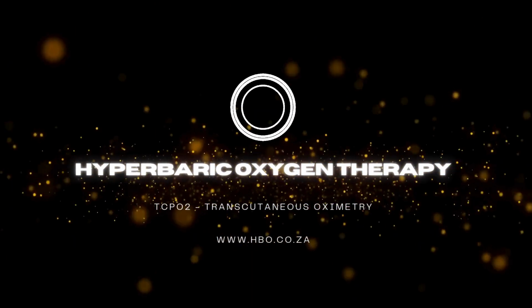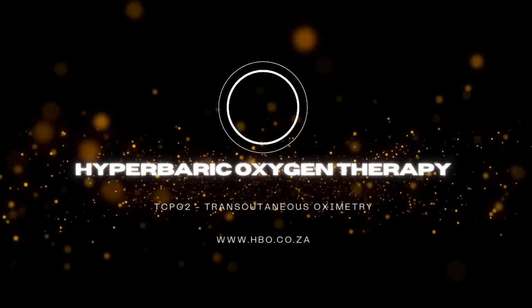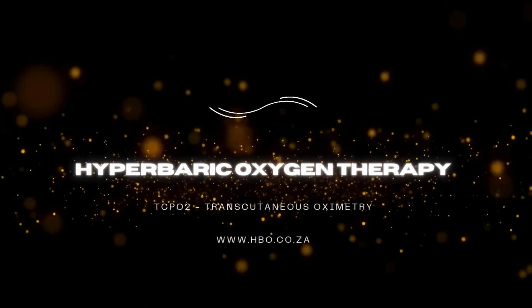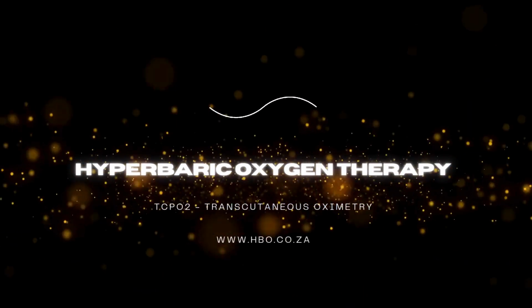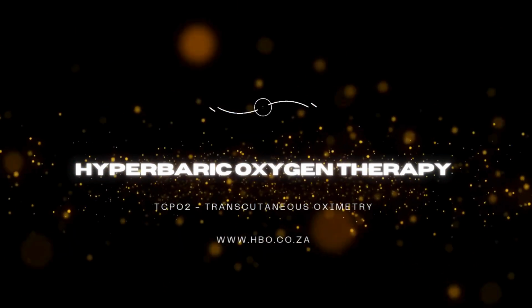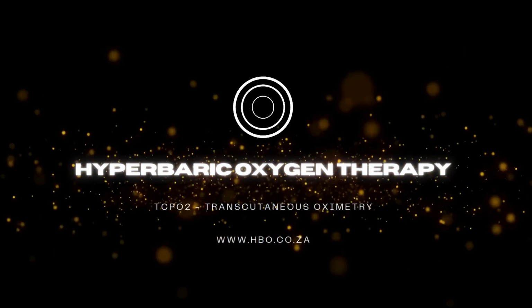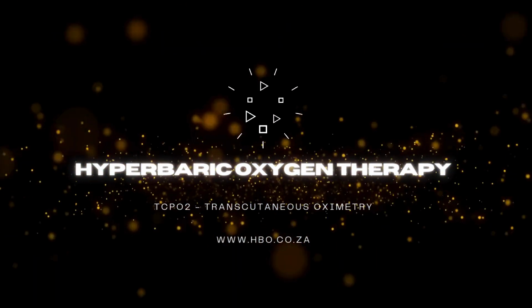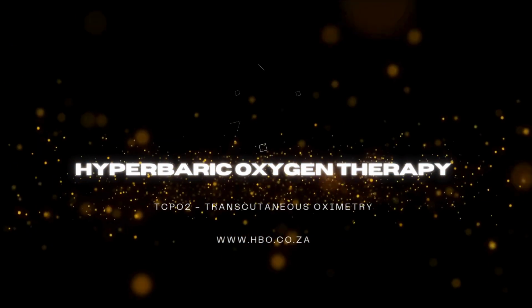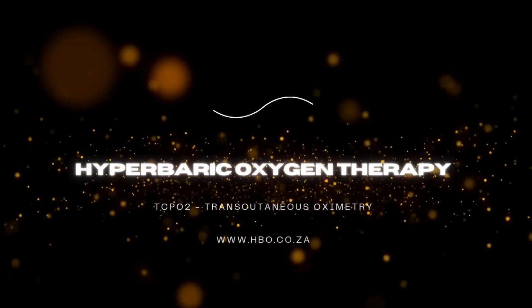Let's drill down into some specific clinical scenarios then. Chronic vascular wounds, ischemic lesions, these seem like prime territory for pairing HBOT and TcPO2. Absolutely. For those, the European Committee for Hyperbaric Medicine consensus back in 2004 really emphasized HBOT's role in getting oxygen back to hypoxic tissues. TcPO2 is the objective measure to confirm you're achieving that. It's especially useful, say, for ischemic ulcers or gangrene, when maybe surgery isn't an option, or when healing just stalls even after surgery. TcPO2 helps guide if HBOT is still warranted.